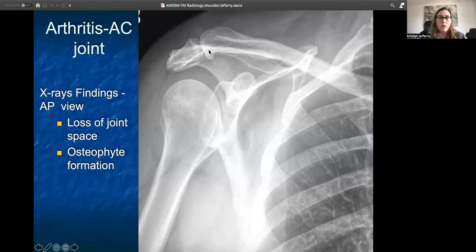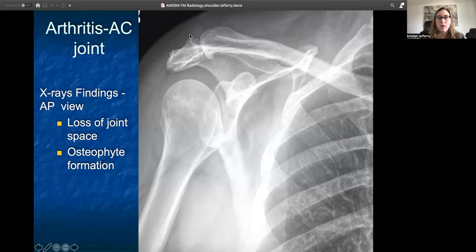Looking at an AP view of the acromioclavicular joint, showing more arthritis: we see loss of joint space between the clavicle and the acromion, and also pretty significant osteophyte formation of both the distal end of the clavicle and the acromion.